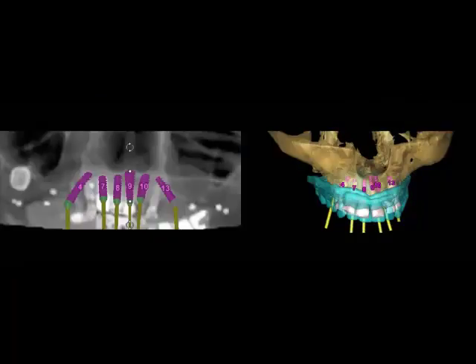So here's our plan. We're going to plan to place 2 implants on a tilted or angular basis, and then 3 remaining implants into extraction sockets. And we're going to use number 7, that implant which is already there, that's integrated. But we put it into the plan so the lab can see it. The laboratory knows that we're going to have an implant in that area.